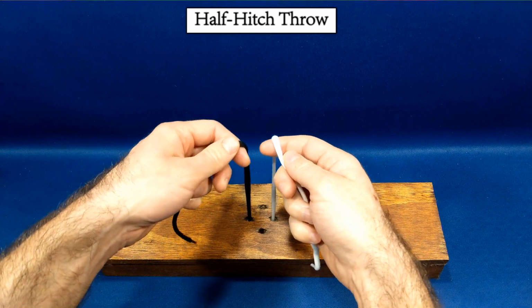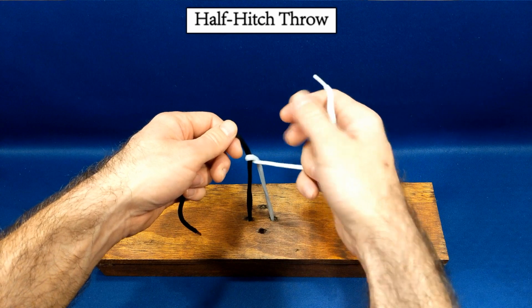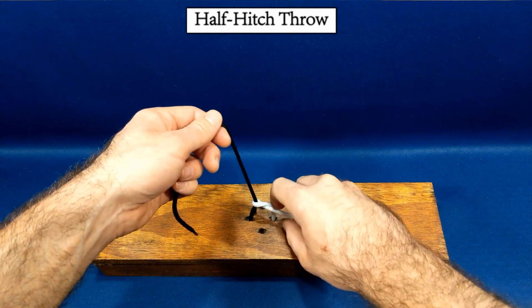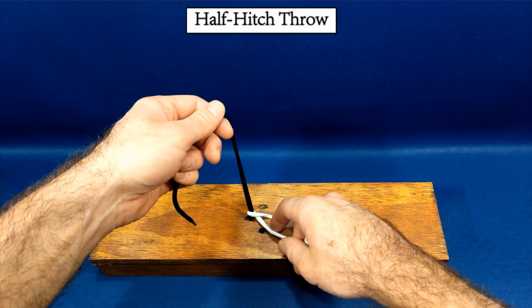This is in contrast to a half-hitch throw, in which one of the two suture strands is held tautly, in this case the black strand, by the left hand, and the other is pushed down to the wooden board, in this case the white strand, by the right hand. Note that the force applied to the black strand is roughly perpendicular to the surface of the wooden board.